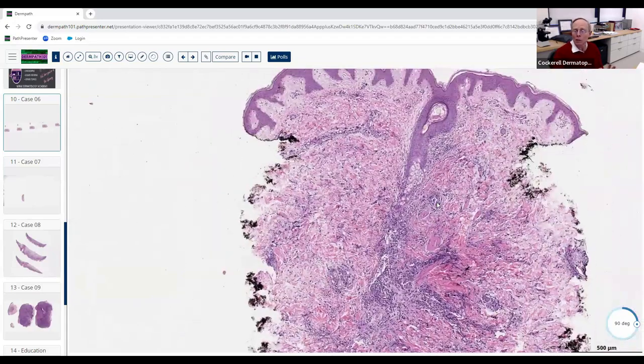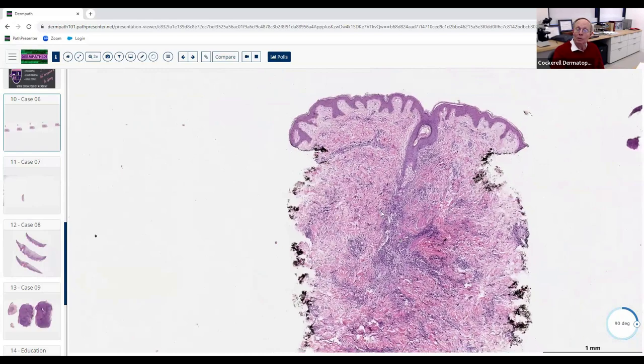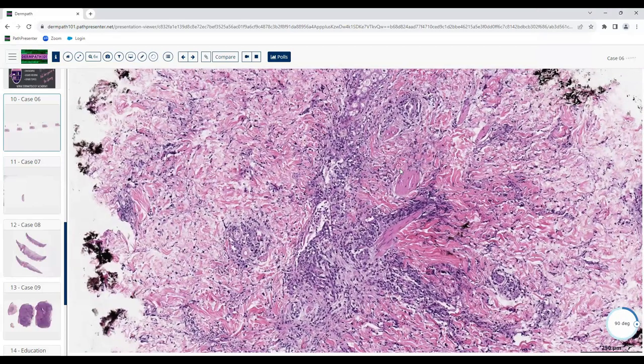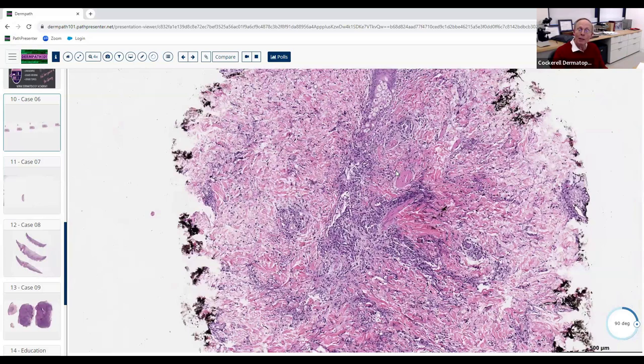Now looking at these cells — they said lymphocytes and histiocytes, but are these normal-looking lymphocytes? They're a bit pleomorphic, darker. Do you need to see mitotic figures to call something malignant? No — you can have the most malignant thing in the world with not a single mitotic figure. So let's talk about the interstitial mostly pattern — what diseases give you this? My differential based on perivascular and interstitial: granuloma annulare and NLD.